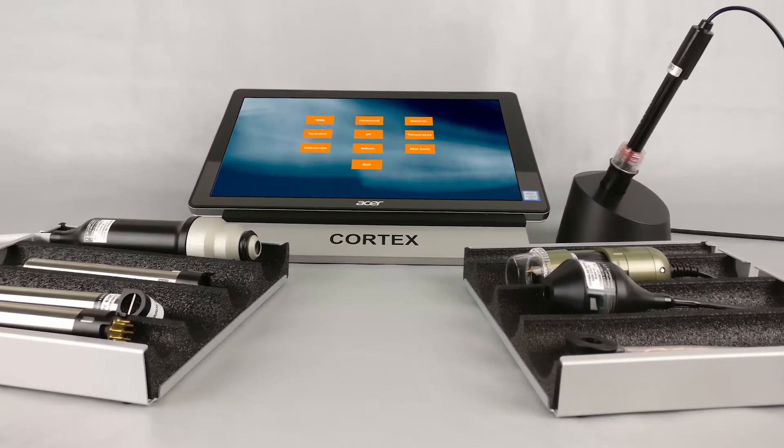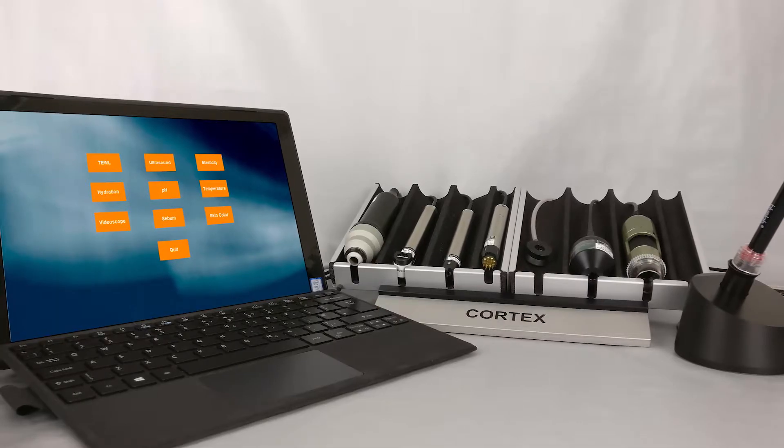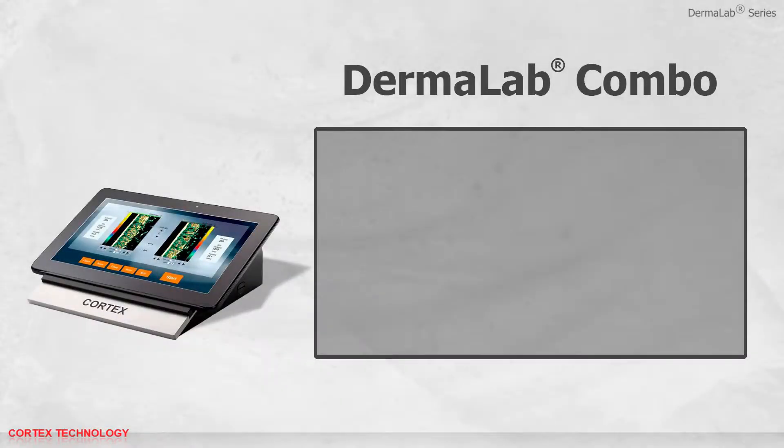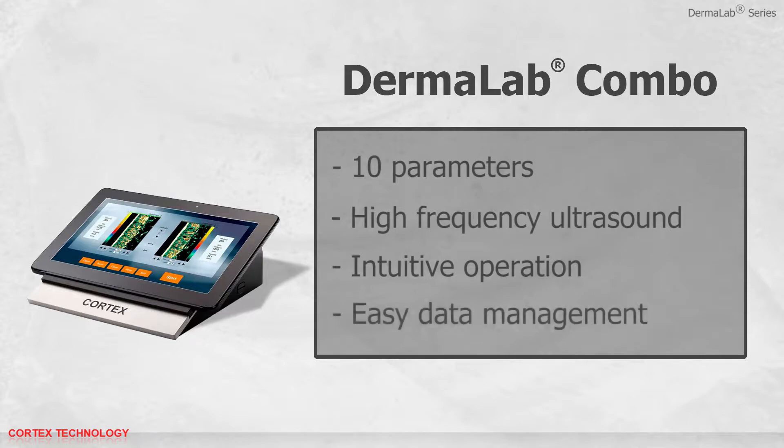The device comes with a wirelessly connected tablet with pre-installed software. The Dermalab Combo features 10 parameters, including high-frequency ultrasound for collagen and skin thickness measurements. It is designed for intuitive operation and flexibility. Data is saved and analyzed, as well as easily exported to third-party programs if needed.